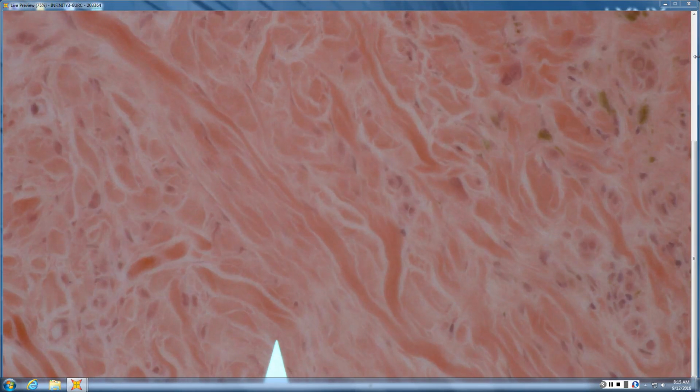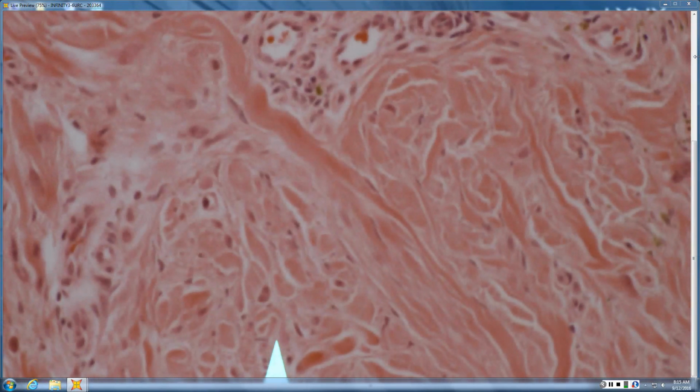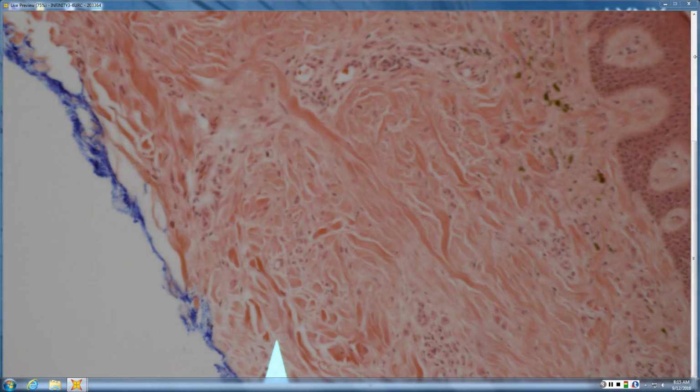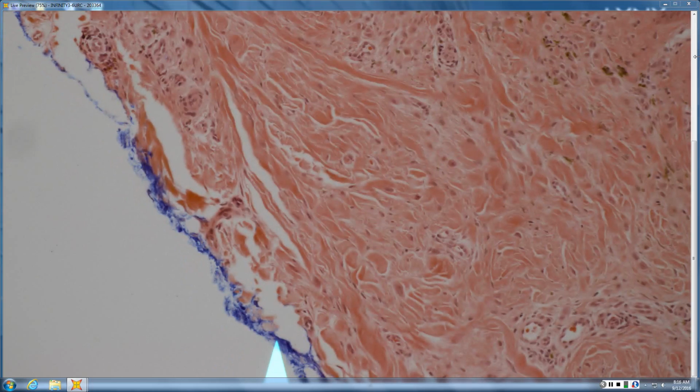I probably should. Any Spitz that's desmoplastic? How about a desmoplastic Spitz? Yeah, exactly. So desmoplastic Spitz nevus, they tend to be purely dermal. They have large Spitz cells, either singly or in theques and aggregates, and they have a sclerotic stroma. And they look like white fibrotic lesions. So the clinician didn't know what it was, but wasn't really worried about melanoma with it. You know, it's usually an avascular, pale, anemic-looking bump, with that variant of Spitz.